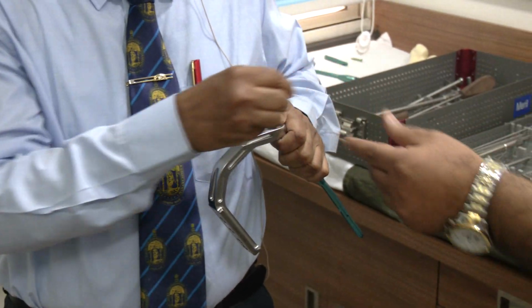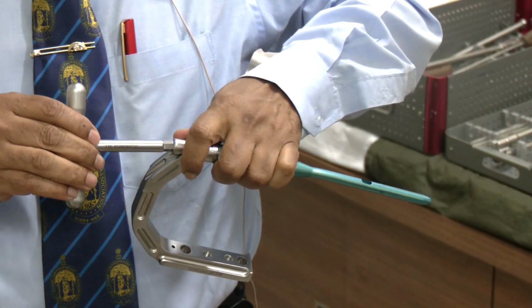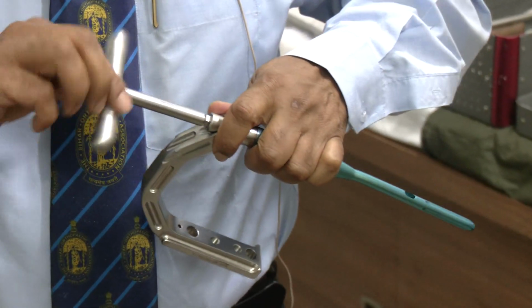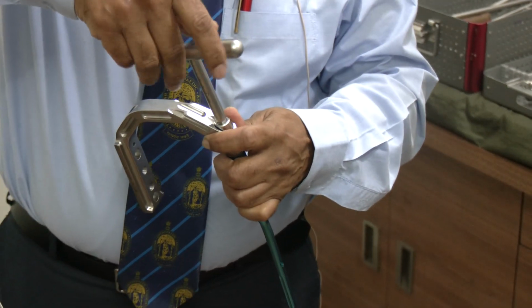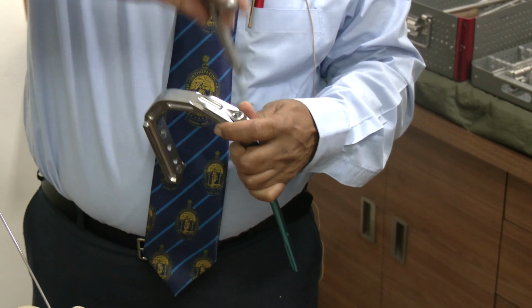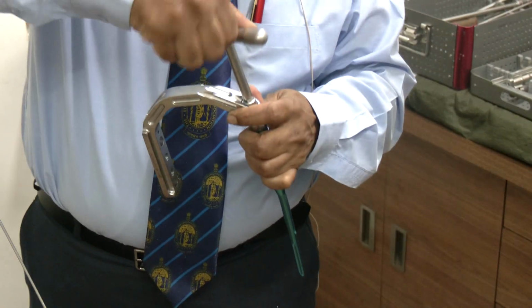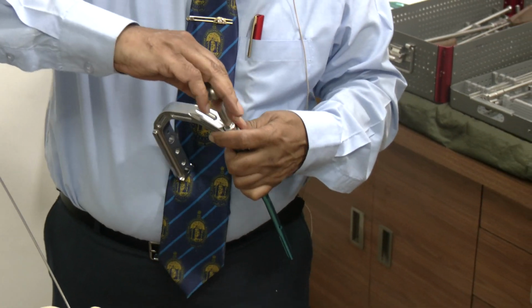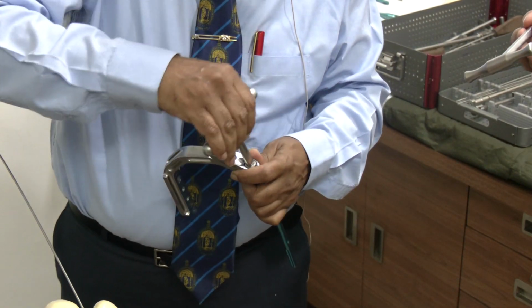Now you can fix the jig to the nail using this T-handle wrench which comes with the set. This T-handle wrench can be used only outside the body when the nail is in your hand, because this does not have any play. But while you are removing, this cannot be easily put on sometimes.